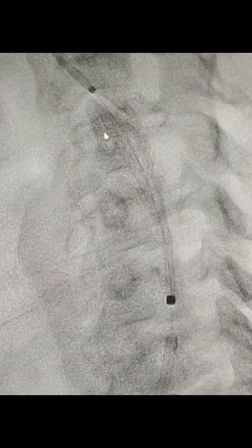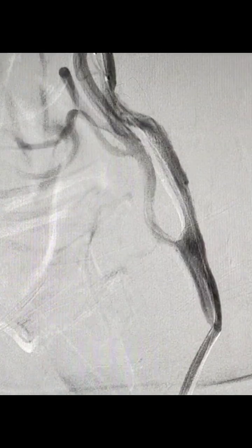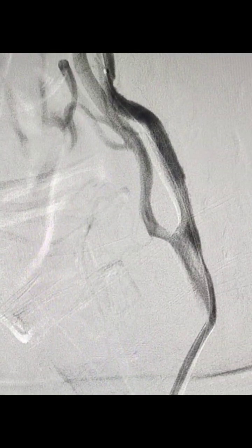In this DSA you can see the stent deployment, and after stent deployment this is the picture. So we need to have the post dilatation. We took a balloon of 6 by 20 for the post dilatation. So this was the post dilatation for 5 seconds. The balloon was 6 by 20.